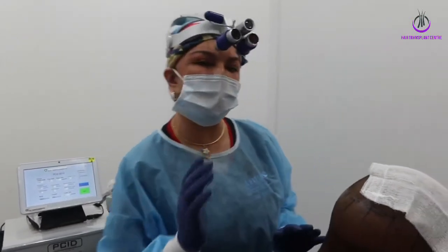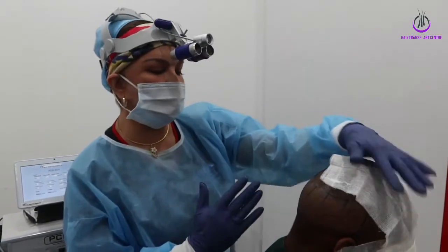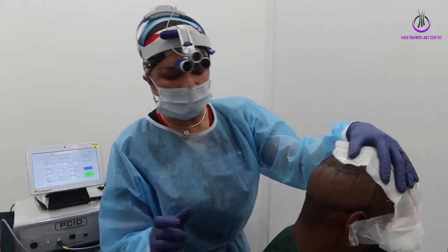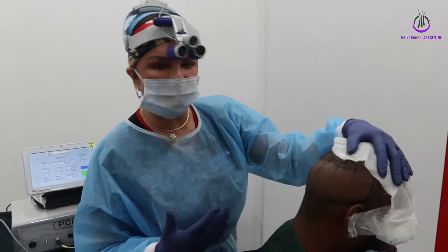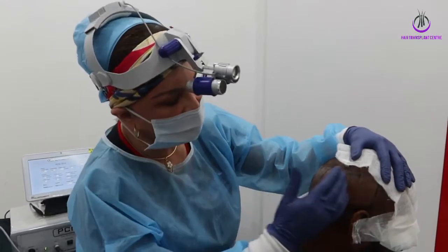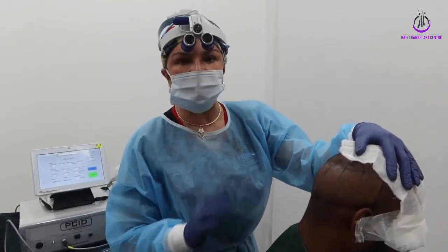Preparation is done. Before I really go into the whole process, I will do test grafts. Test grafts are done basically at the middle here, to see where the hair follicles are and that the punch size is equal, so that the transection rate is not there. Before we go on with every harvesting, we do a little bit of test grafts at all the boxes to see that everything is correct, and then we start the whole procedure.